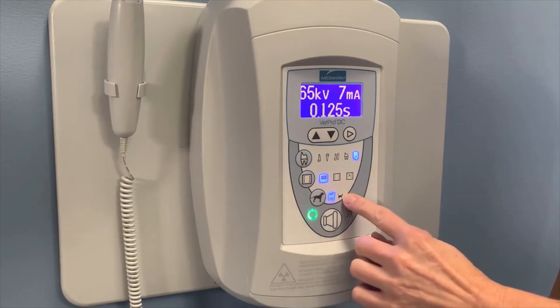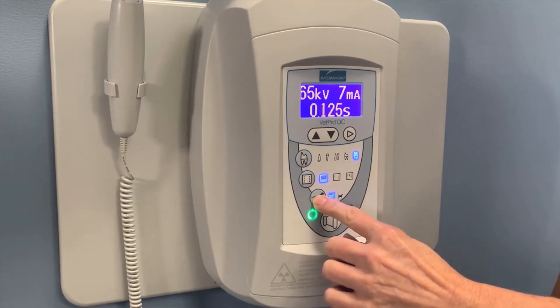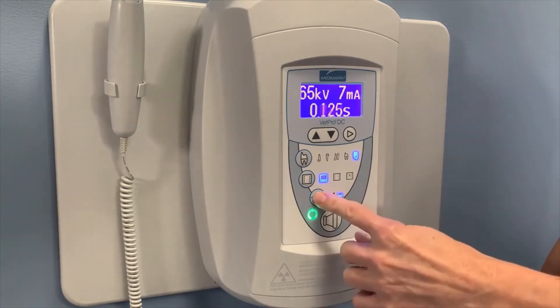Here are the patient selection buttons. We have canine and feline options. Anything under 30 pounds, I will use the feline settings for.